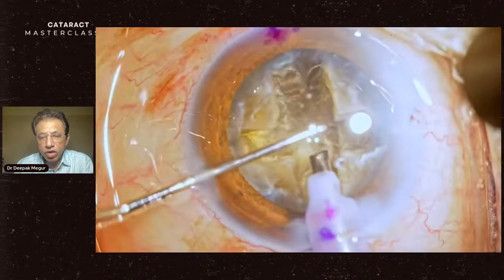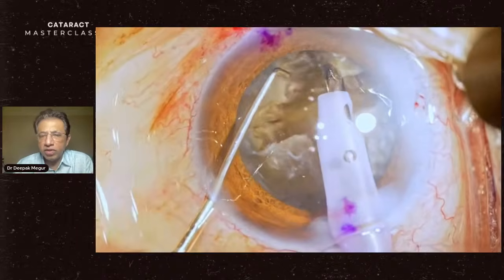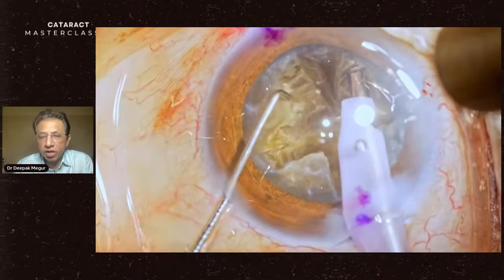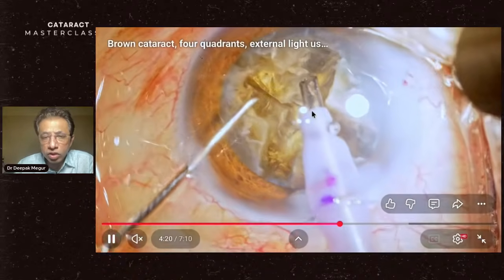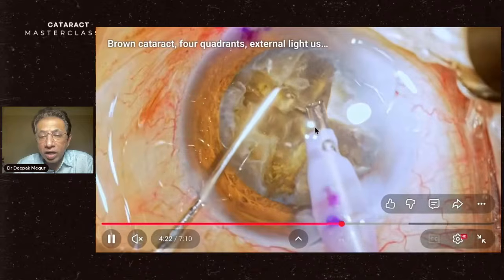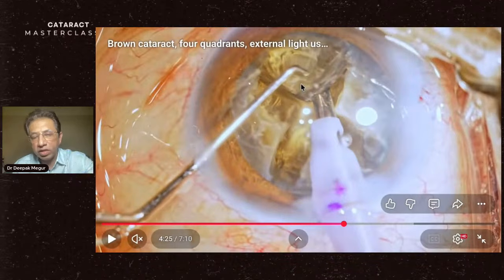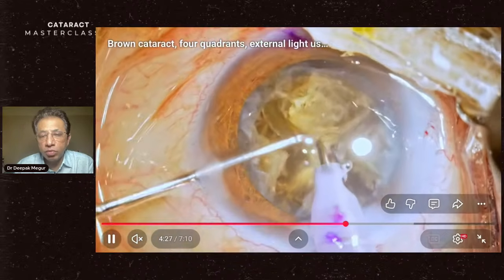Okay. So now there is one more fragment which is to be left. When you're doing this, the maneuvers are very controlled. There is no rush. There is no undue stress being put. And now what happened? You have got 4 fragments, but out of this, only one fragment is well and truly divided. So what I do, I just gently push it away so that the base is turned up towards me. I pick it up with my phaco probe and then pull it out.